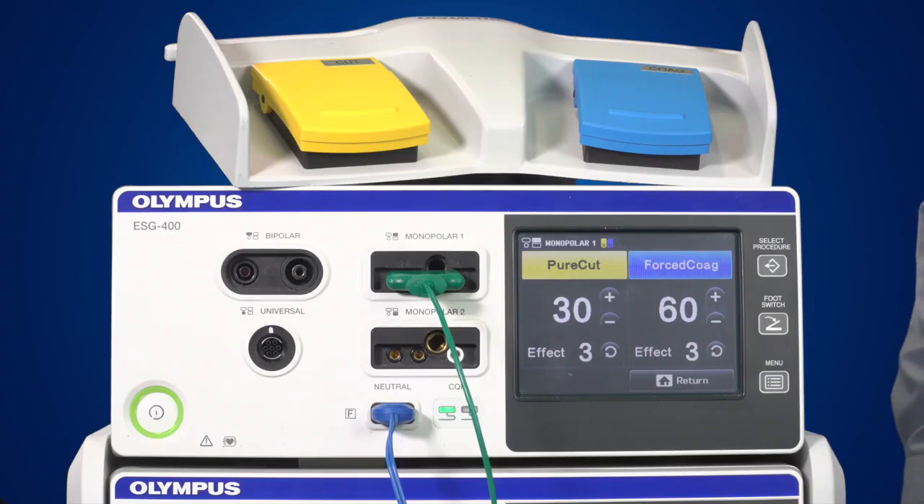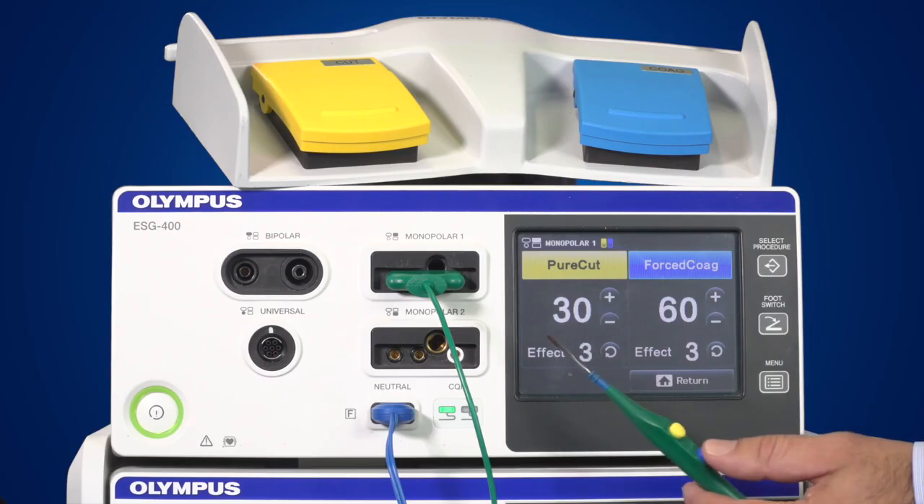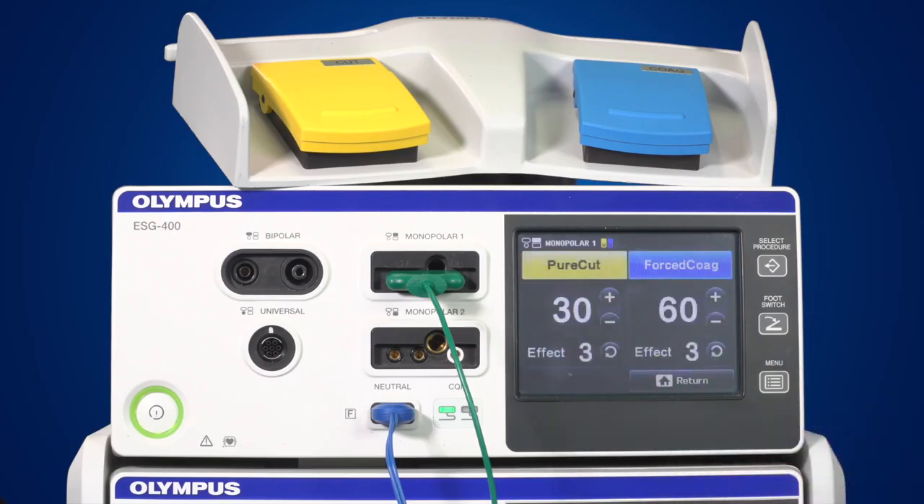Instruments can be activated in two ways: either by using a foot switch or a hand switch. The foot switch supplied with the generator has a yellow cut and a blue coagulation pedal. A separate foot switch with a single blue coagulation pedal can also be purchased; this is used for coagulation only. In order to avoid confusion, you can only connect one single and one double foot switch to the generator.